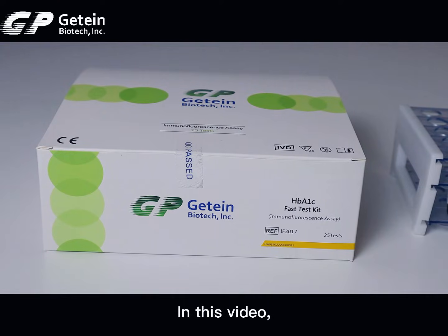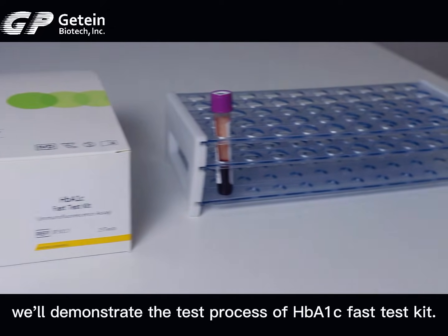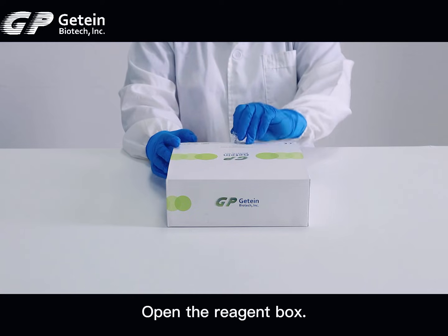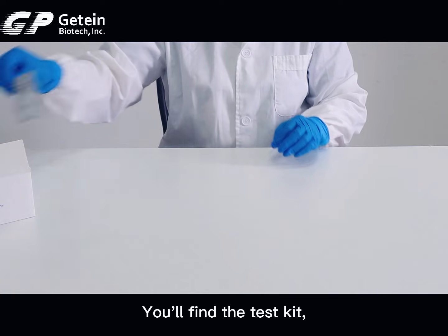In this video, we'll demonstrate the test process of the HBA1C Fast Test Kit. Test Procedure: Open the Reaction Box. You'll find the Test Kit inside.